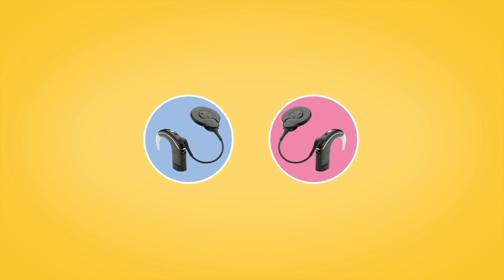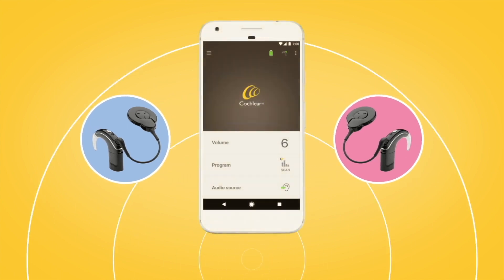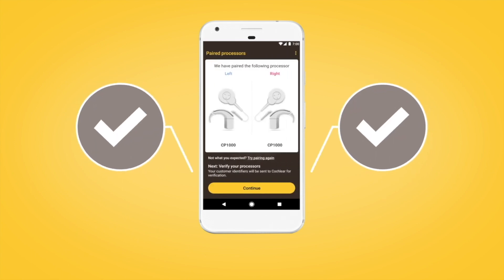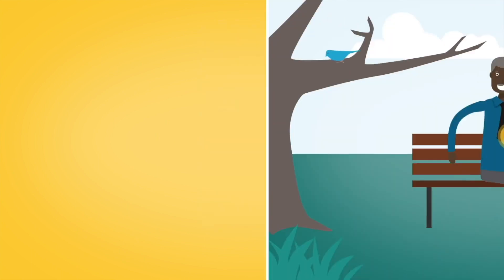If you have two sound processors, both need to be paired during the same pairing window. To do this, turn each of your sound processors off and back on again. Your compatible Android device will search for your sound processors and display them as a pair on the Processors Detected screen. Select your sound processors to begin pairing them. You will need to verify each sound processor individually. Follow the screen prompts to complete verification and pairing for both sound processors as previously described.